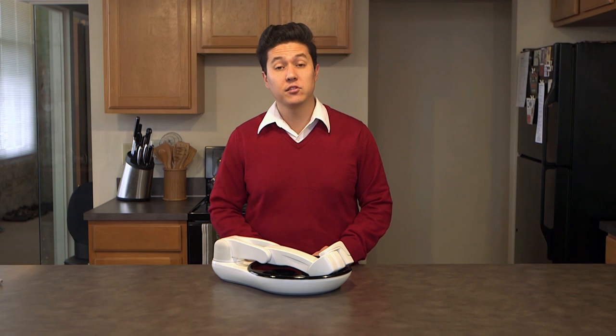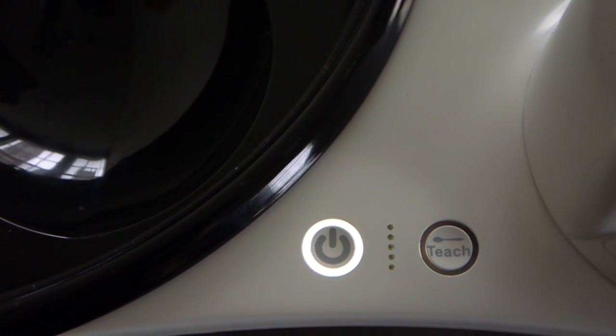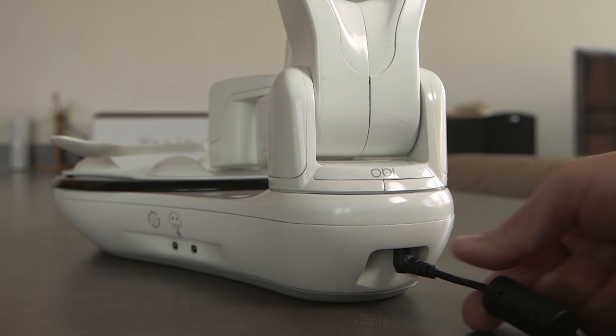When only one battery LED remains illuminated and flashing, it's time to charge OB. Using only the cable provided, please insert it as shown.